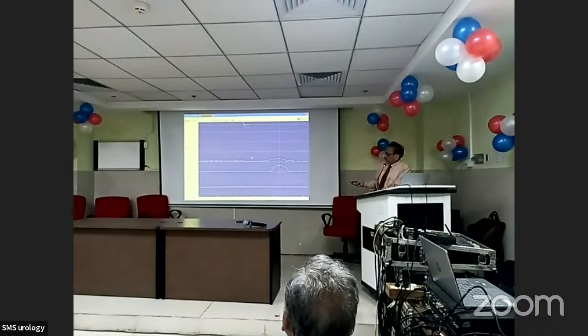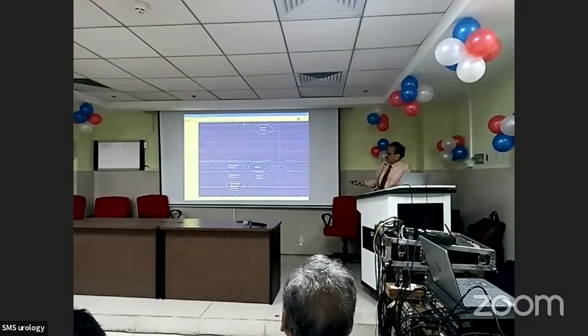This is my orientation. The blue line is for bladder, the red line is for rectum, green for uroflow. So my orientation would be: this is intravesical pressure, this is abdominal pressure, that's the basal pressure. And that's how a normal recording of a female should look. Look at the quality, this is very important.